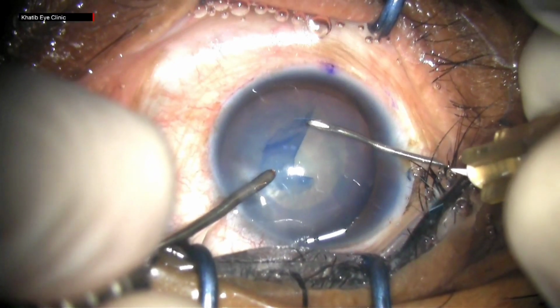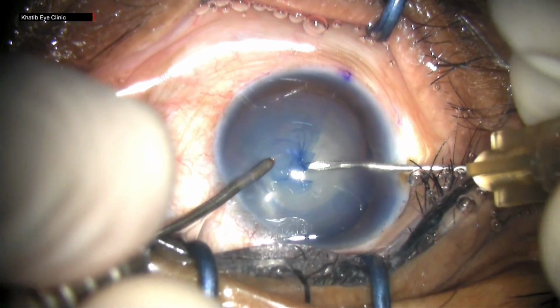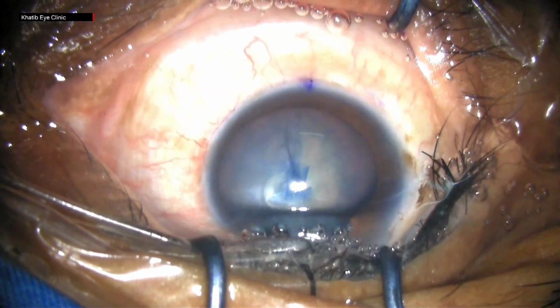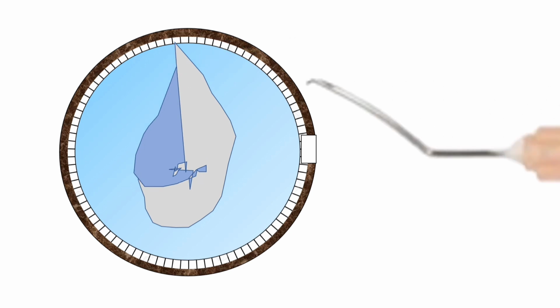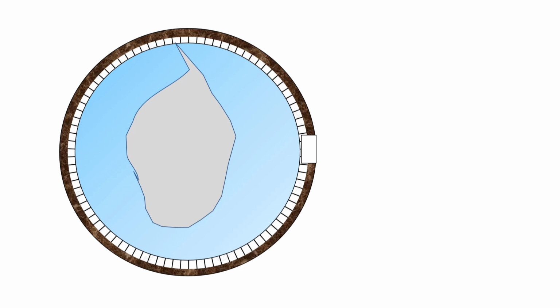Unfortunately, this is exactly what I do. I pull inwards and forwards, and as expected the Rhexis has now gone further out to the zonules. So what next? A lot of surgeons would give a cut at this stage and finish the capsulotomy, but as we know, a free flap during phaco can be a recipe for disaster. If we understand the basics of vector forces, we should be able to complete the Rhexis every single time, no matter how far out it has gone. Let us see what we can do in this situation.